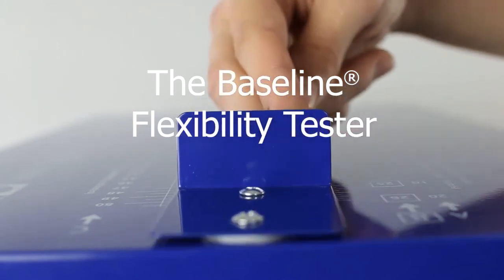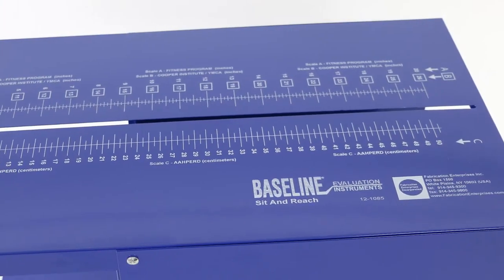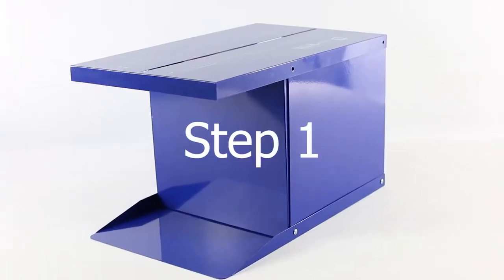The Baseline Flexibility Tester. To assemble the baseline standard flexibility tester, start by assembling the box.